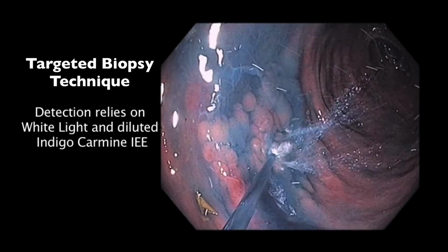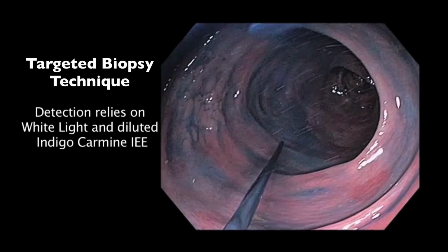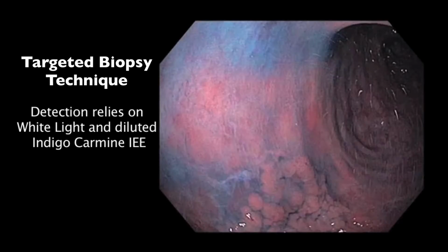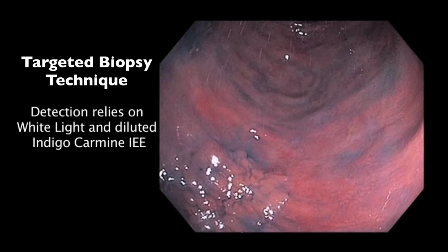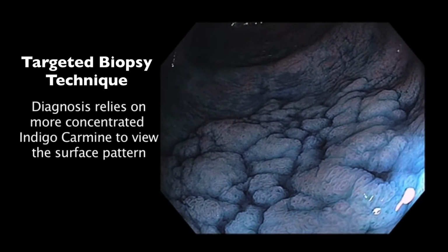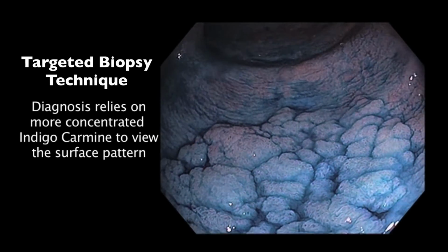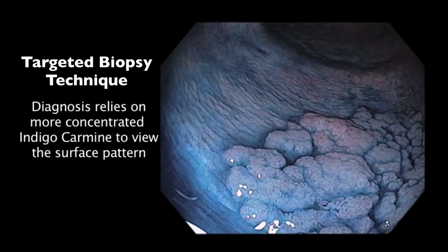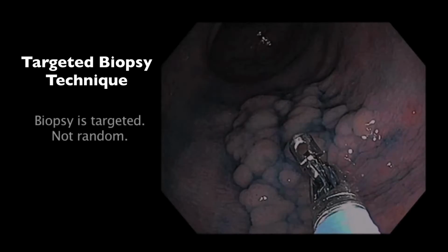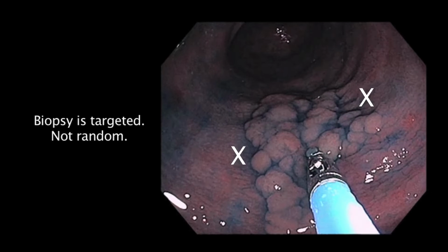The technique of chromoendoscopy is shown here. Using high-definition instruments, dilute indigo carmine is applied using the forward wash jet. When lesions are identified, more concentrated indigo carmine is applied via the biopsy channel to better delineate the lesion extent and the mucosal detail. Targeted biopsies are then taken of the lesion. Biopsies are also taken around the lesion to exclude flat, invisible dysplasia, which would render it endoscopically unresectable.